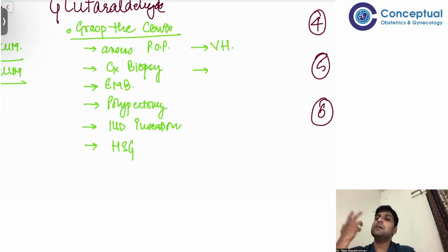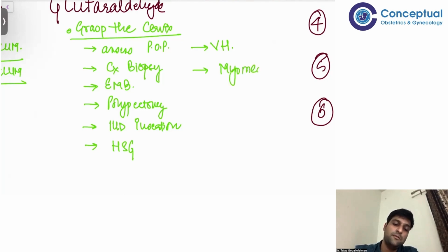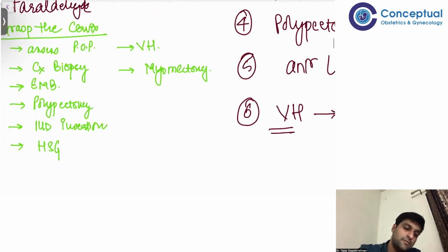Usually for that, we use a myoma screw. Or we can use any other instrument which has a good grip. And that grip can be provided by your Vulsellum. So an offbeat use, it is used for myomectomy. Right? Now, the cervix we grasped, grasping the cervix is not going to happen in myomectomy.